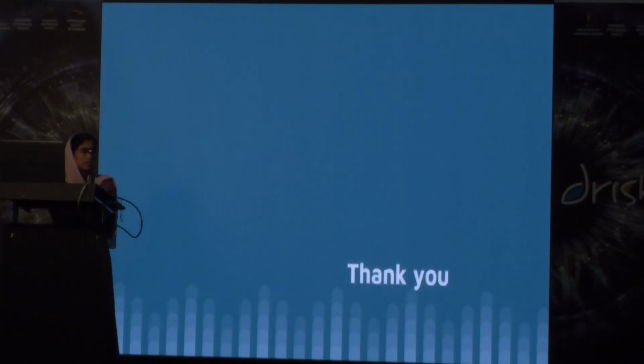Yeah, the patient had central corneal opacity. The patient had a scar due to trauma, and following the surgery, the patient had improvement up to 6/36. Though the near vision was not improved, the near vision was less than N36. So maybe some part of the pupillary area was clear. Some part of the pupil should be spared.